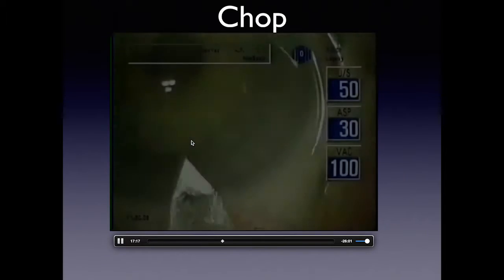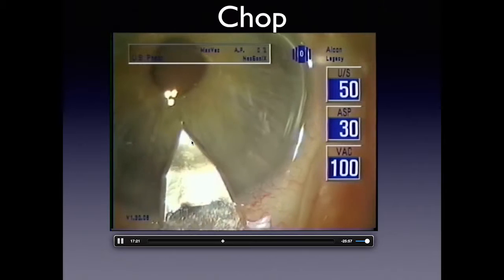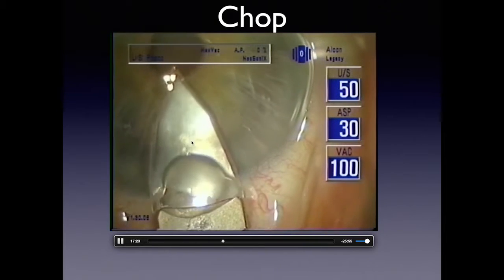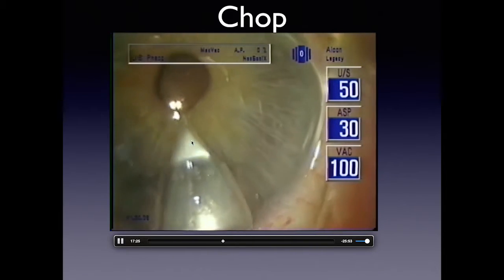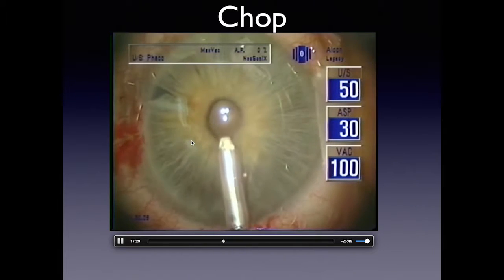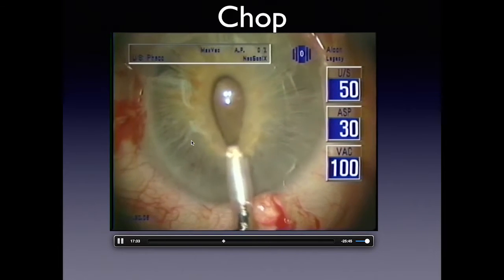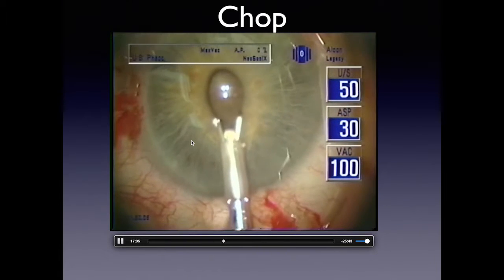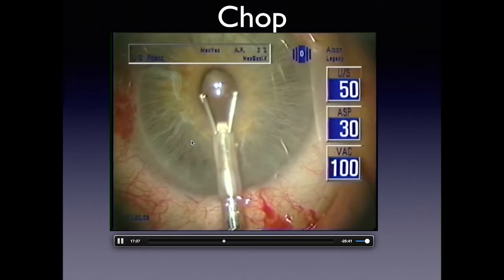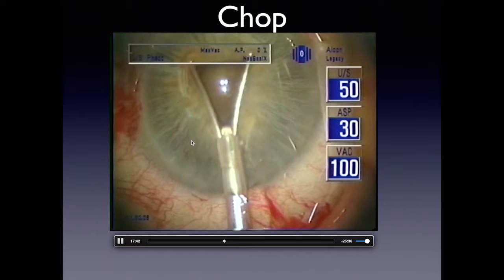You want most of the action to occur right in the middle of the rhexis. Your phaco handpiece needs to be slightly past the halfway point toward your temporal incision so the nuclear material is emulsified in the actual center of the cataract. It's also important to understand that the incision is critical — a square incision is easy to manipulate, and at the end you can hydrate the wound to achieve a complete seal without sutures.